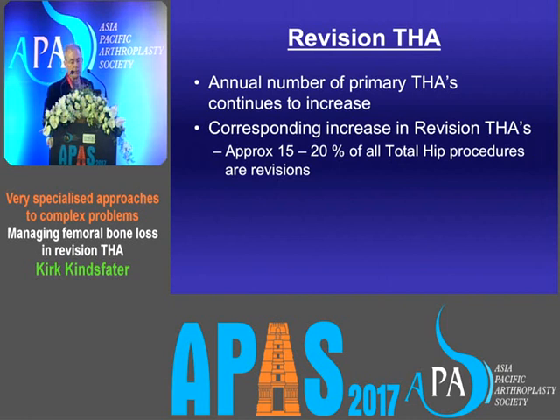We have less ability to reconstruct bone on the femoral side. A lot of these acetabular bad defects you've seen are somewhat contained, which lends itself a little bit more to reconstruction. It's a little harder on the femoral side.